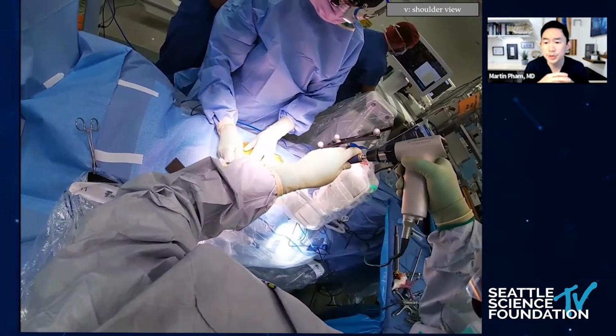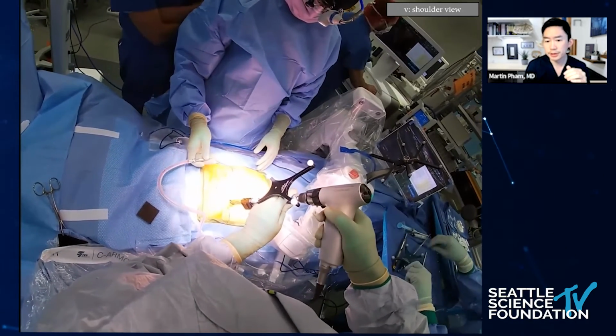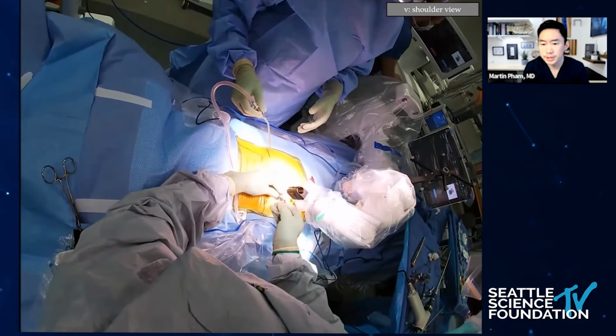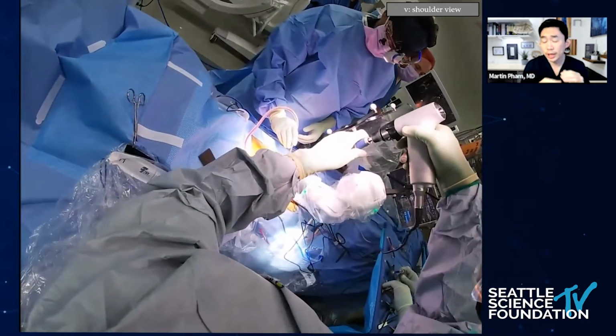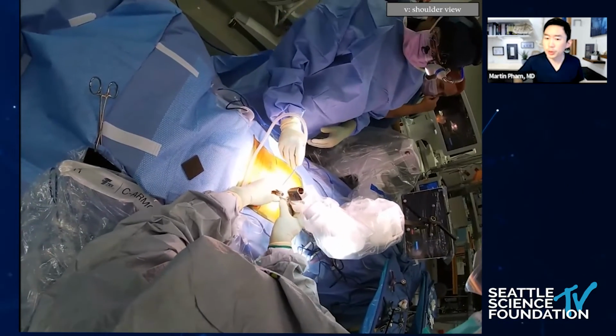And again, as you'll see here, this is the top screw. I put screws proximal to distal just because you're going from farther away from the arm to the closest distance to the arm, so the potentially least accurate. And in this way, it's just a paraspinal incision. And you can see how straightforward it is, right?